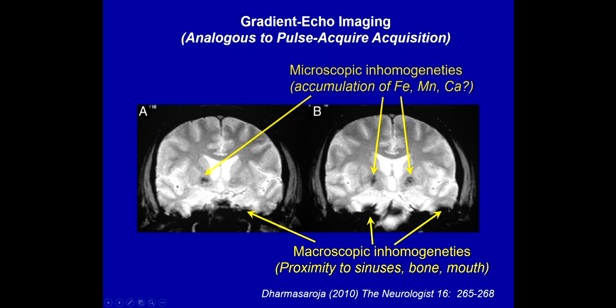This is something actually you can exploit. We'll talk about it later. But for fMRI, you rely on this for most approaches that use fMRI. There's the BOLD effect, blood oxygen level dependence. Oxygenated hemoglobin distorts the magnetic field. As you might imagine, hemoglobin has iron in it, but it distorts it very slightly. Deoxygenated hemoglobin also has iron in it, of course, but it distorts it much more severely than the oxygenated version.